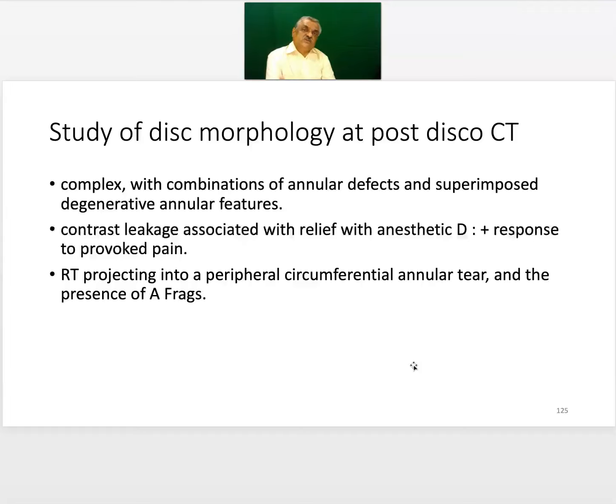We also listen to the patient about elicitation of the pain, and we find that the patient gets pain, the patient may have a leaking of the dye, etc. But we are unable to see the cross-section of the disc, especially in a disc where it is a contained disc or posterior annulus may be intact or healed. So a post-discography CT is important in those patients where we may be able to see the internal architecture of the disc which had changed.